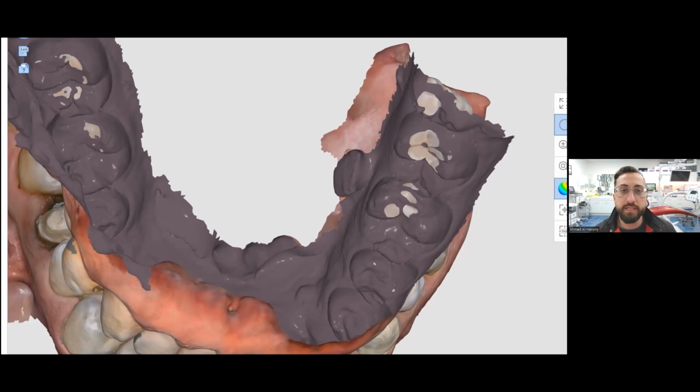There's a lot of theories, guys, why this happens. Prevailing theory is periodontal ligament. As we all know, our teeth move when we bite down. And if you want to feel that, you can just put your finger on your upper canine and then bite down really hard. You'll feel it move. So this is one of the reasons why people think this happens with intraoral scanners, that there's this periodontal ligament movement, especially in patients who have very bad perio.